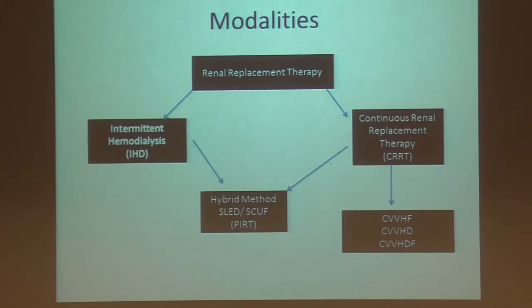When you're talking about CRRT, they'll recommend blood flows as low as 50 to 100 ml a minute, sometimes 200. If you're crossing 200 ml a minute on CRRT, you might as well go to hemodialysis. There's no point stressing them that much on a CRRT machine. Usual blood flows are going to be 150 to 200. When you run your blood flows very low, you risk clotting, but I'll talk about that later. So CVVH is the default method. Anytime you read CVVH, the method of clearance will be convective clearance.